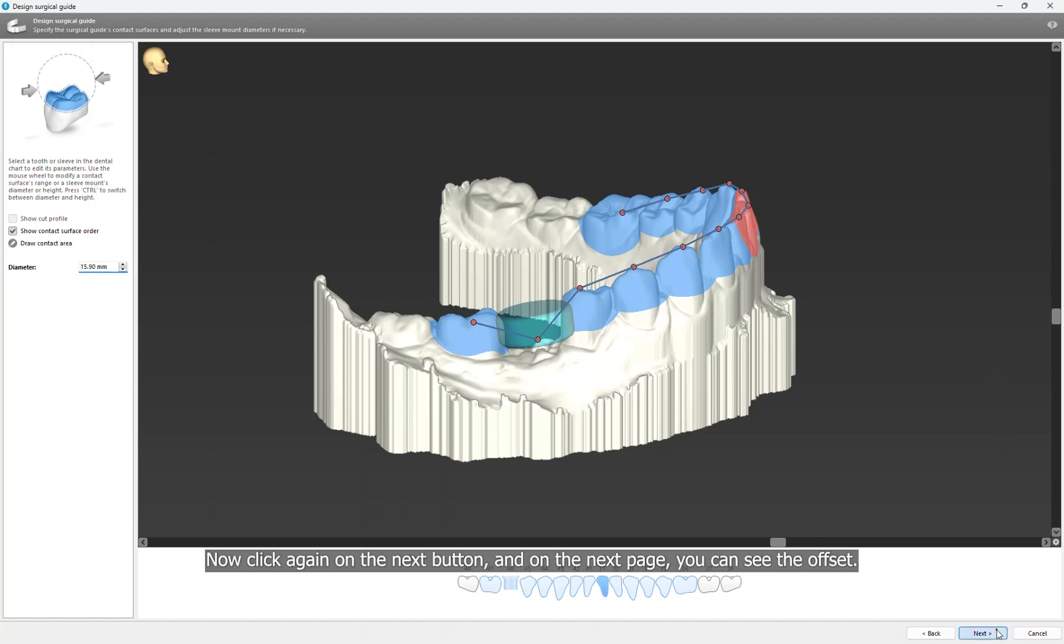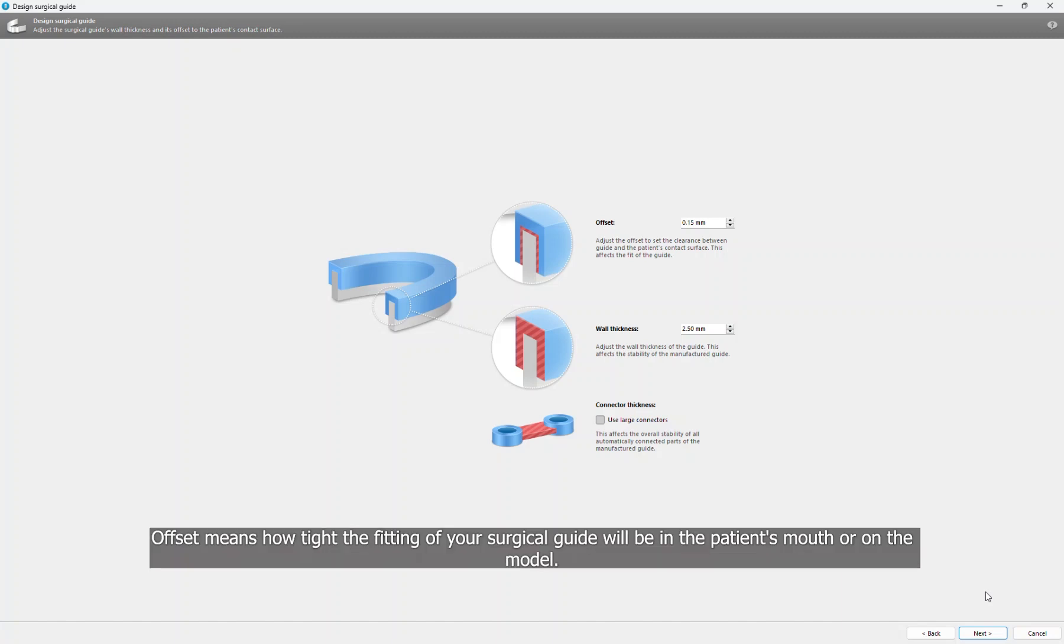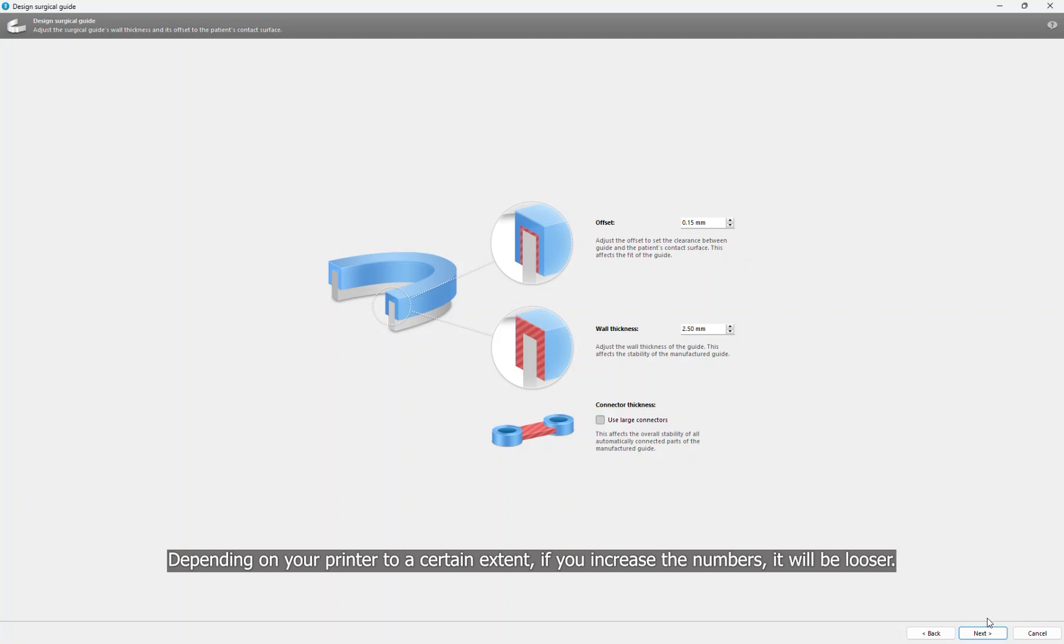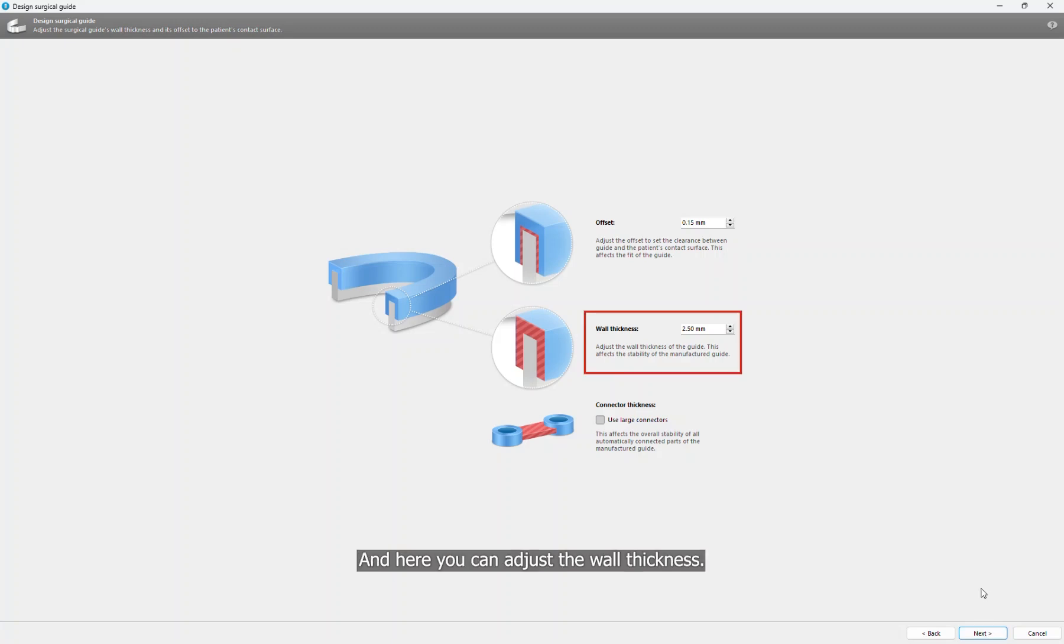Now click again on the Next button. And on the next page, you can see the offset. Offset means how tight the fitting of your surgical guide will be in the patient's mouth or on the model, depending on your printer. To a certain extent, if you increase the numbers it will be looser. If you decrease the numbers it will be tighter. And here you can adjust the wall thickness.